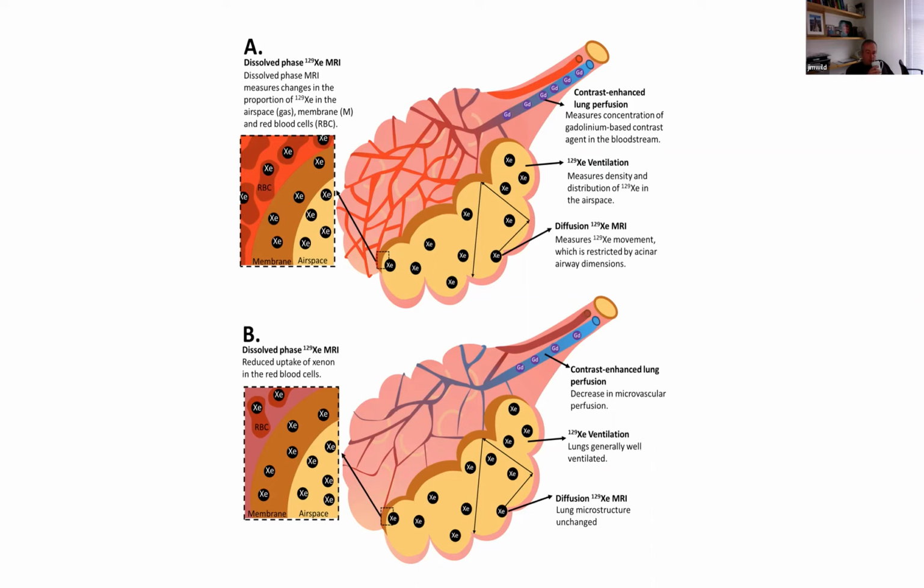Red blood cells are just not getting through and picking up oxygen as well as they are in healthy lungs. And that is consistent with what people are complaining about in terms of their breathlessness. So it's kind of shunting of the capillaries, so that blood is just not getting into the capillaries. And that's reflected by the two sets of measurements.